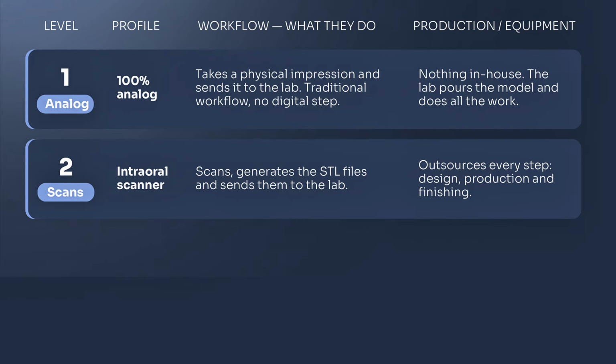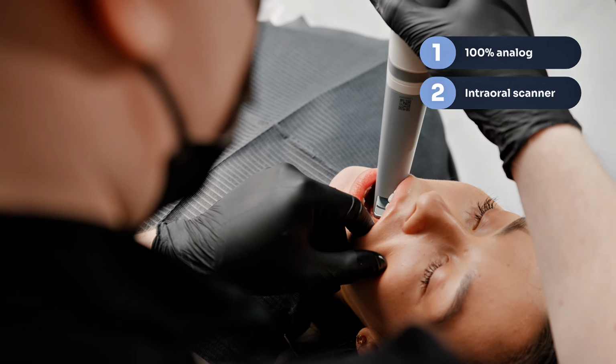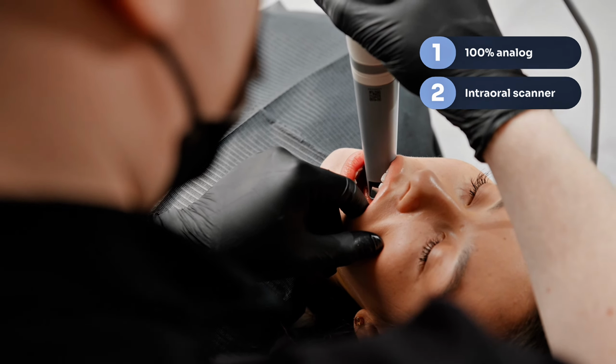What would be the profile of the kind of doctor that is on level 2? It is the doctor that has a scanner, and is basically using the scan to generate the STL files and send them out to the lab, outsourcing pretty much every step of the process to the lab. So design, production, finishing, everything goes out to the lab.